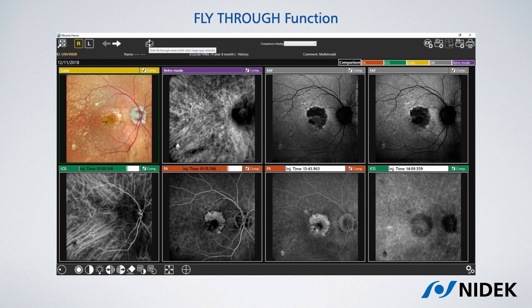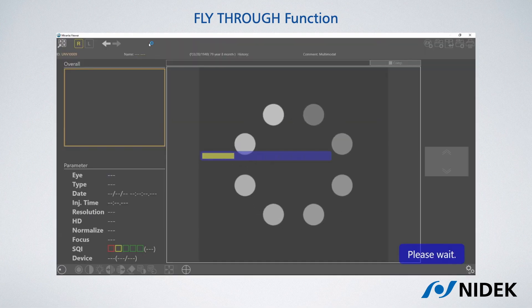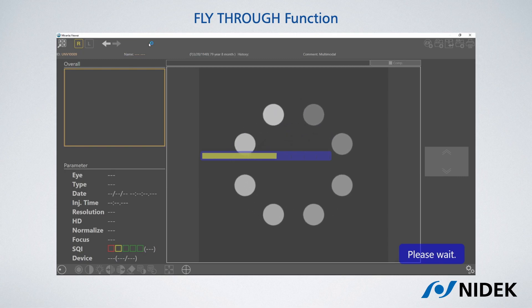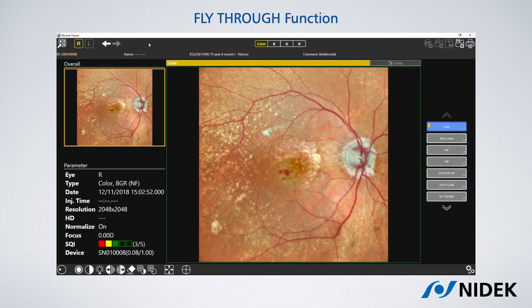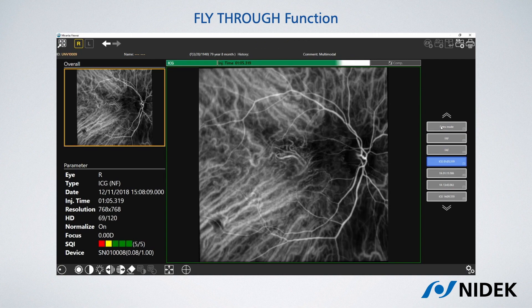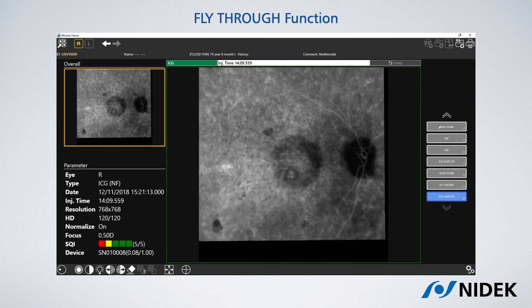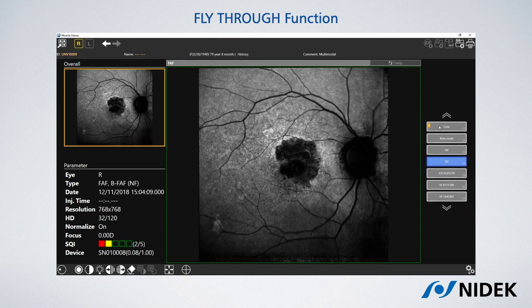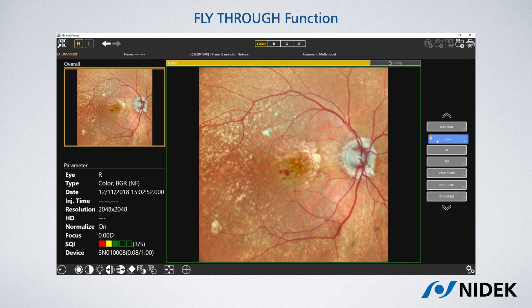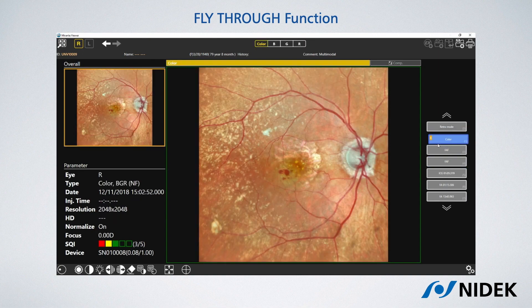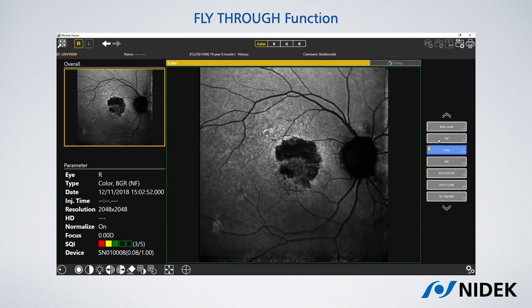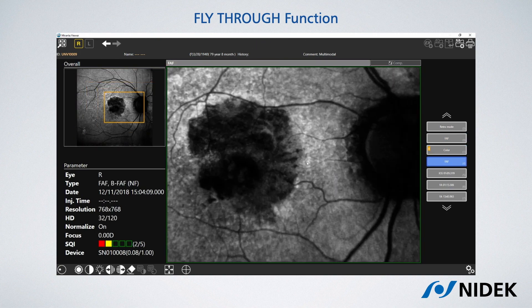When it comes to reviewing the SLO images, you can take advantage of the fly-through function. The fly-through function puts in one-to-one anatomical correspondence a larger set of images coming from the same fundus, taken in different modalities, by stacking them up while registering them. This allows you to scroll through this stack of images and easily see what the same anatomical point looks like in the various modalities, ensuring maximum accuracy for your diagnosis.